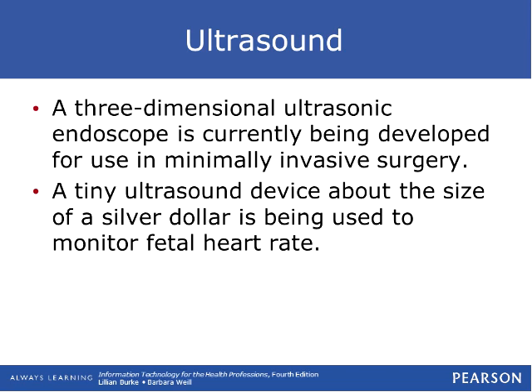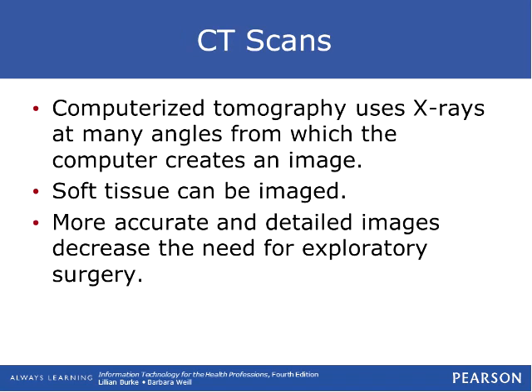Ultrasound gives you a three-dimensional ultrasonic endoscope, which is currently being developed for use in minimally invasive surgeries. So we can insert this endoscope, and then we get an ultrasound of the area around it. So a tiny ultrasound device about the size of a silver dollar is being used to monitor the fetal heart rate. So it's a pretty interesting technology that technologically is getting much more efficient and complex.